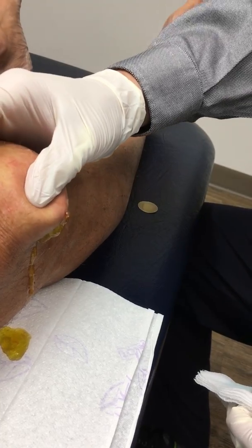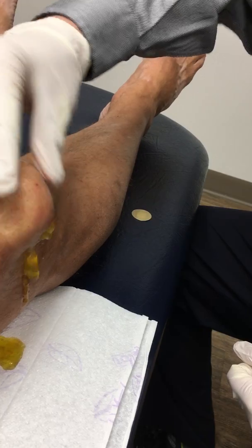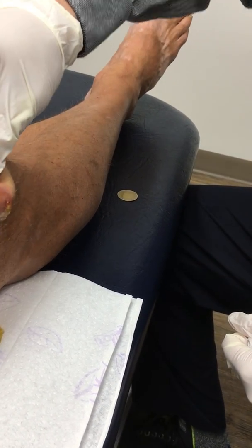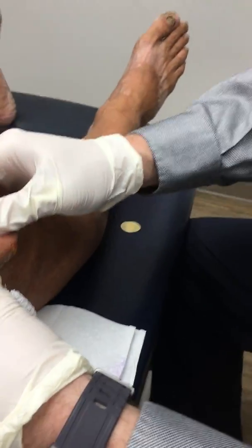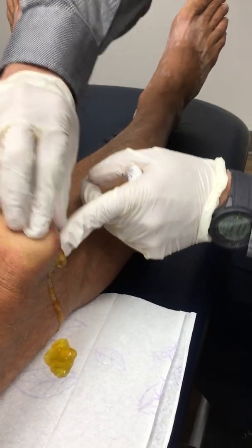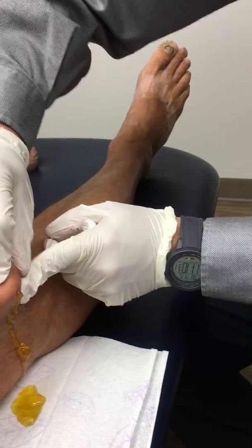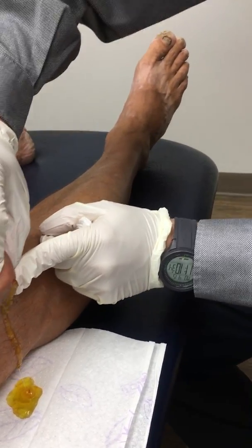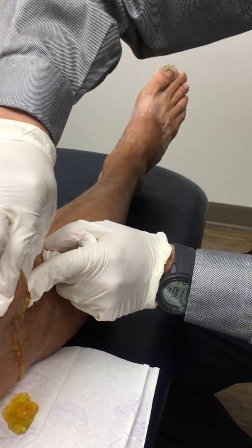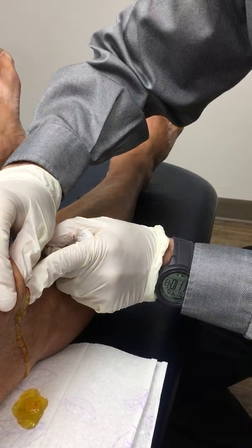Versus if it's really acute, it's very liquidy. I hope I'm not blocking the angle. So I'm kind of milking these different compartments here for a second. And I promise I'll clean up your leg when we're done. Let's see if I can get... I've learned not to put my face right down by it when I do this. Kind of like when you're delivering babies, I've learned it's always a good idea to wear a face shield and a mask. Good, and that's probably about all I'm going to be able to squeeze out.